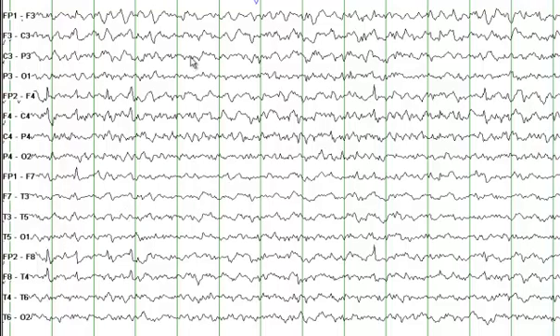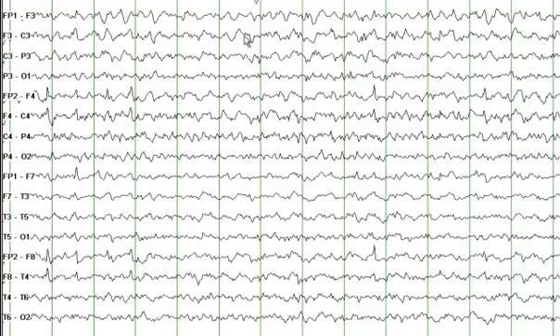You see slowing in both the left hemisphere. Between these two green lines there is a one-second time interval, and if I count the number of waves — 1, 2 — this is sort of a delta frequency. You also see some superimposed fast frequency which is in the beta range.